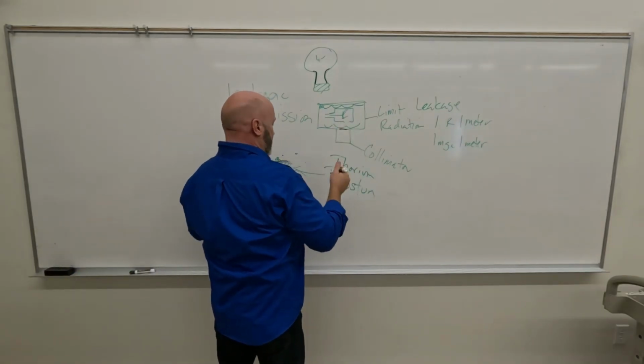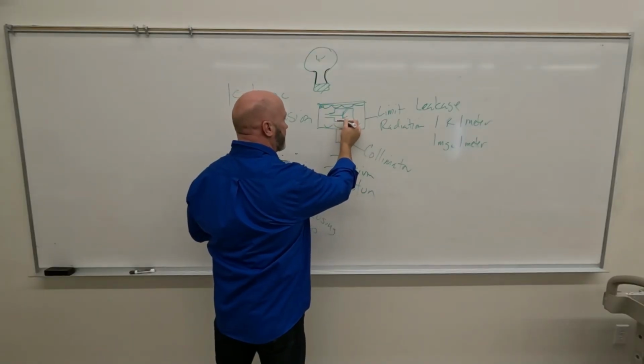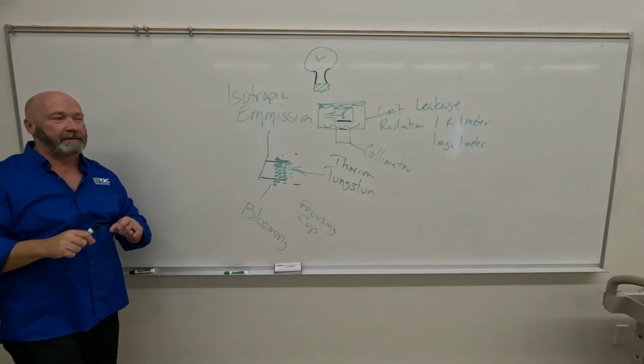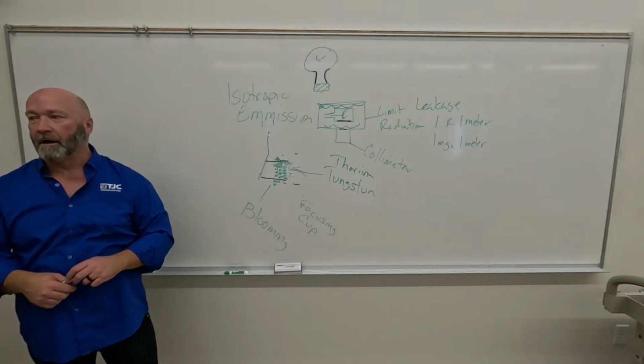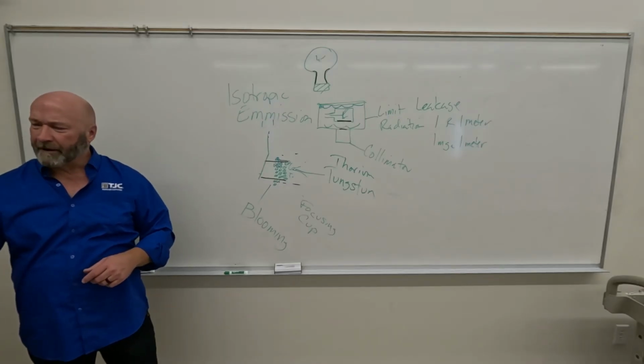Okay? So if it coats the inside of the x-ray tube, then that's a very thin layer of metal that you've laid down inside of it. What was it before? All glass, right? So glass, very radiolucent.